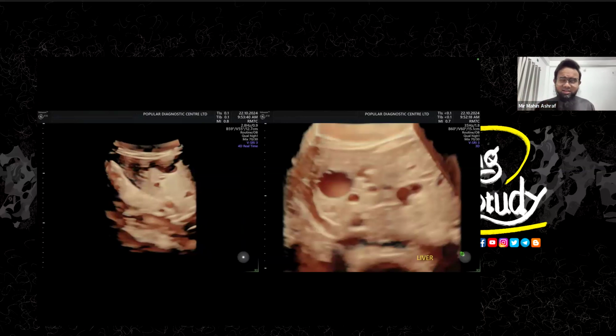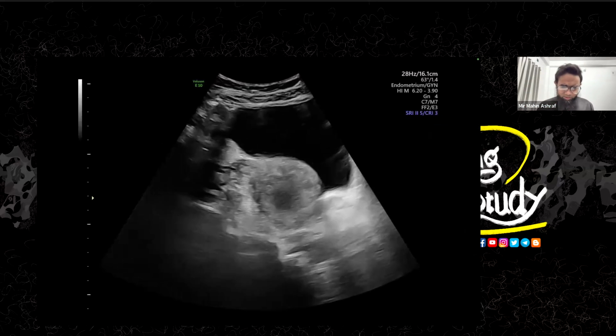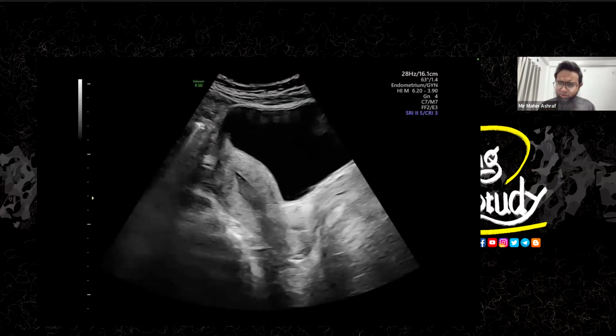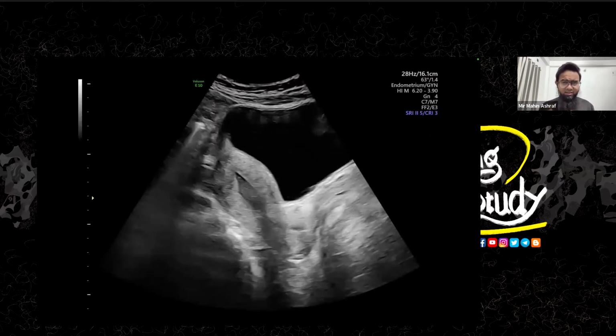Okay, so this is a female patient. So let's jump into the uterus of this patient. I'm actually showing you this case for the uterus, not for the liver. So let's jump into the uterus. The patient has got a history of chronic lower abdominal pain. So she came with that history.